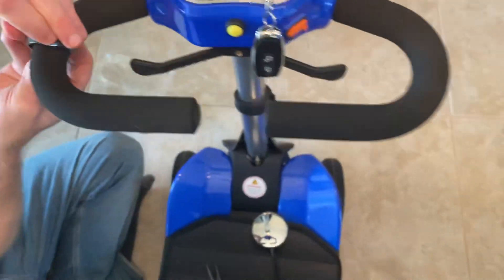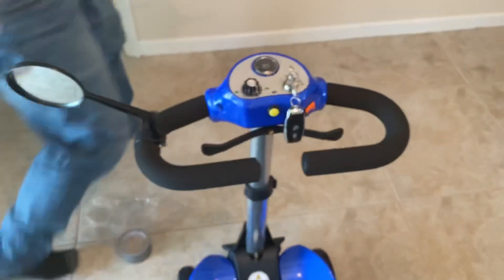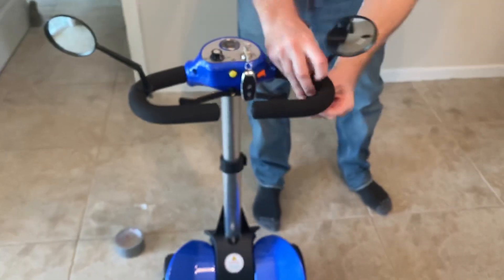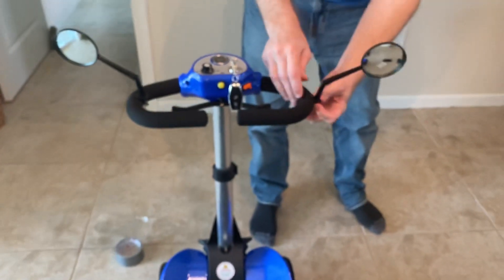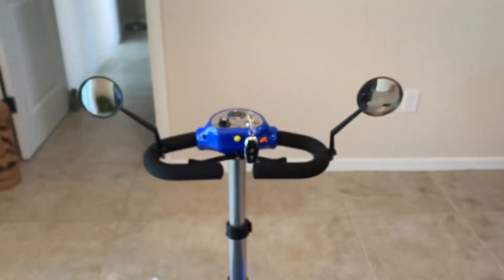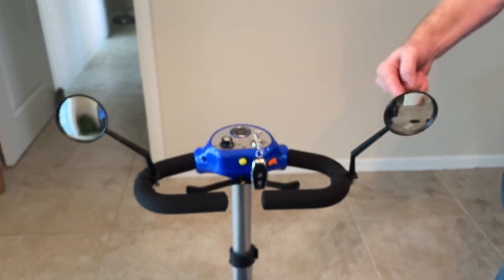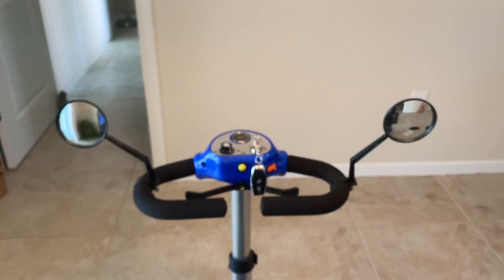There we go. Now I have a mirror for one side and a mirror for the other side — adjustable mirrors. I now have two mirrors on the Optimus Automatically Folding Mobility Scooter. Now you can enjoy rear-view mirrors. Thank you.